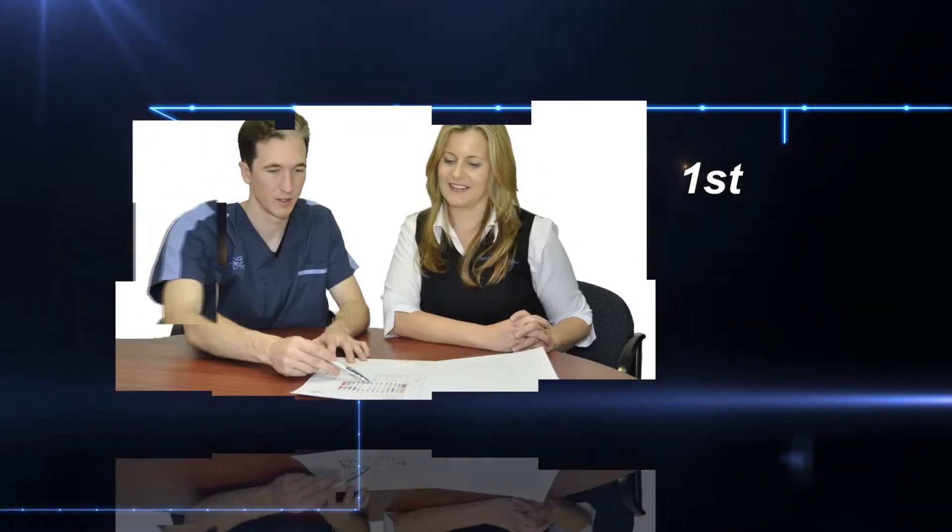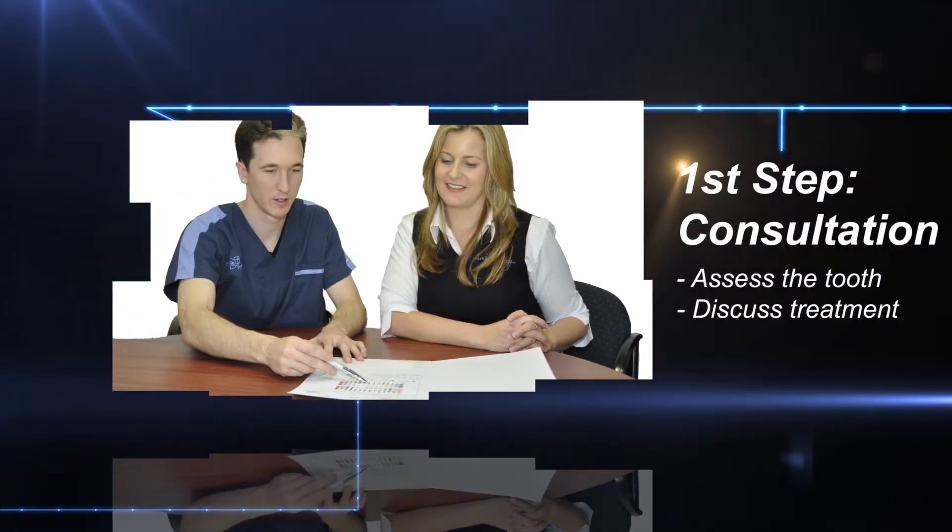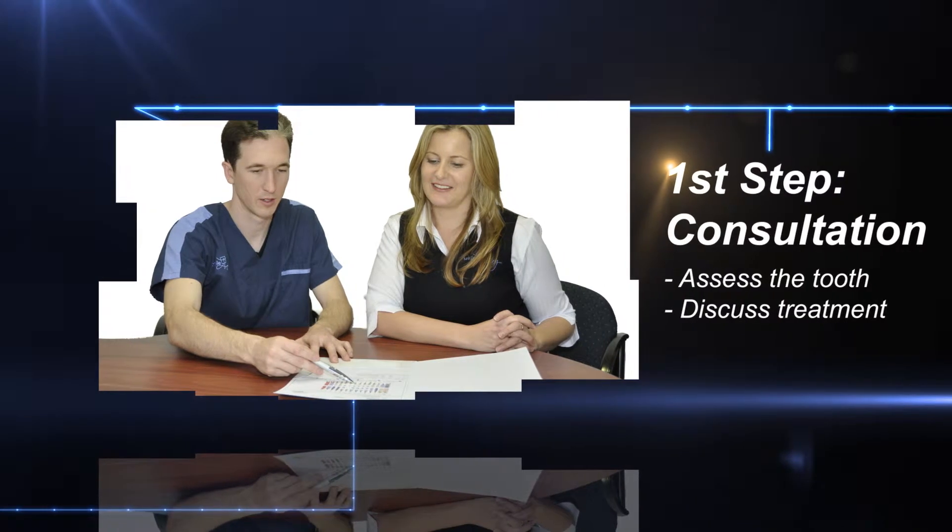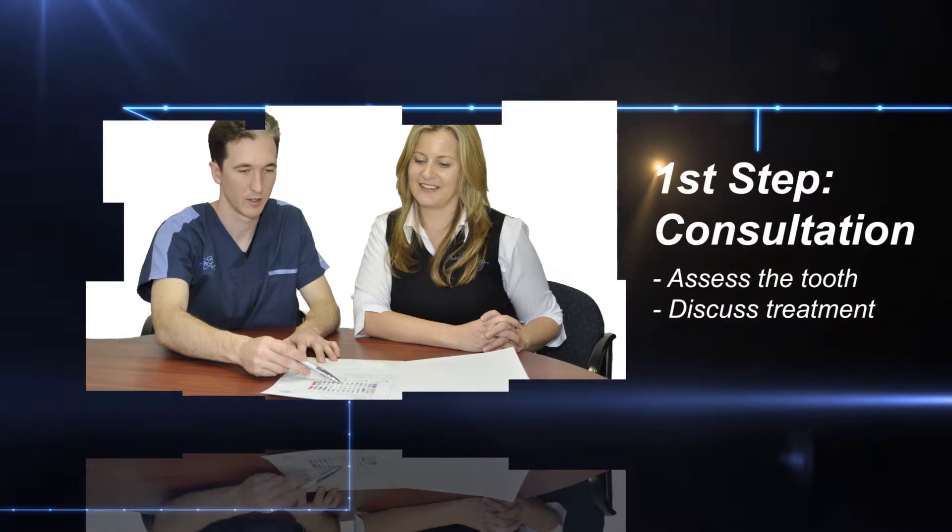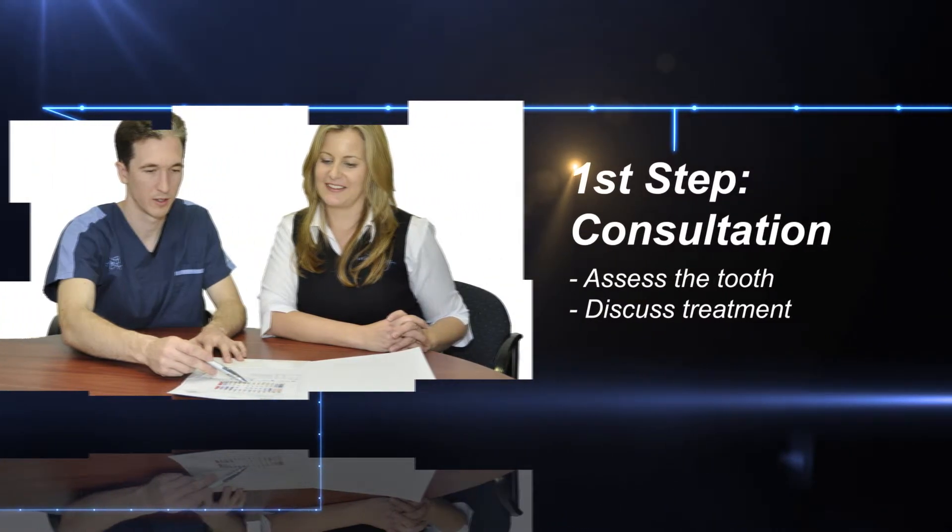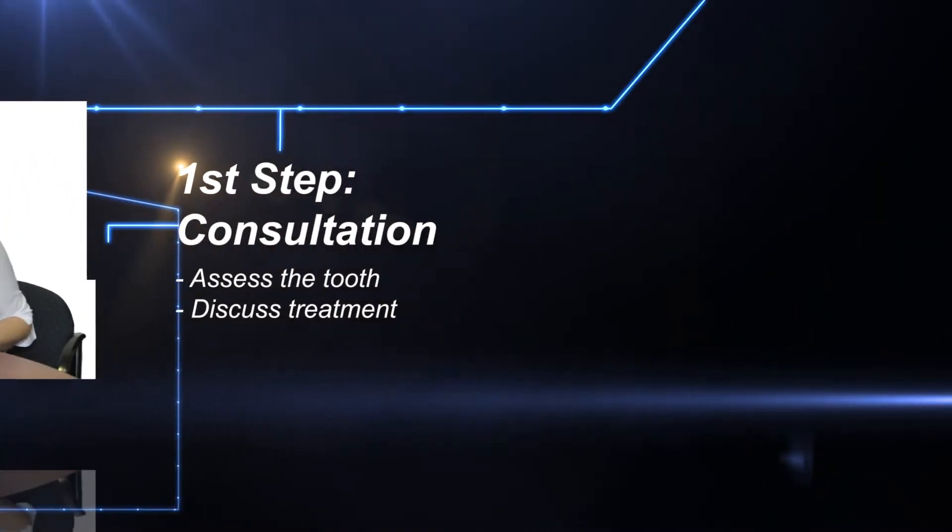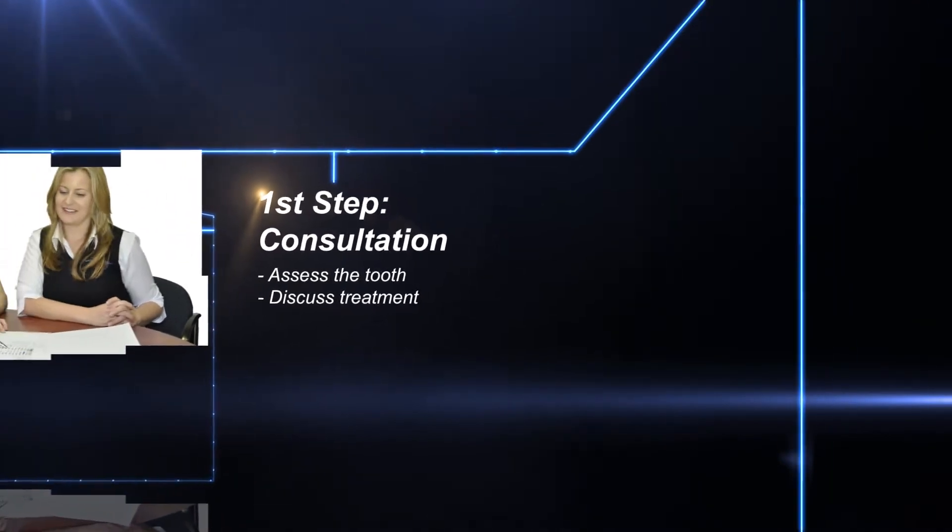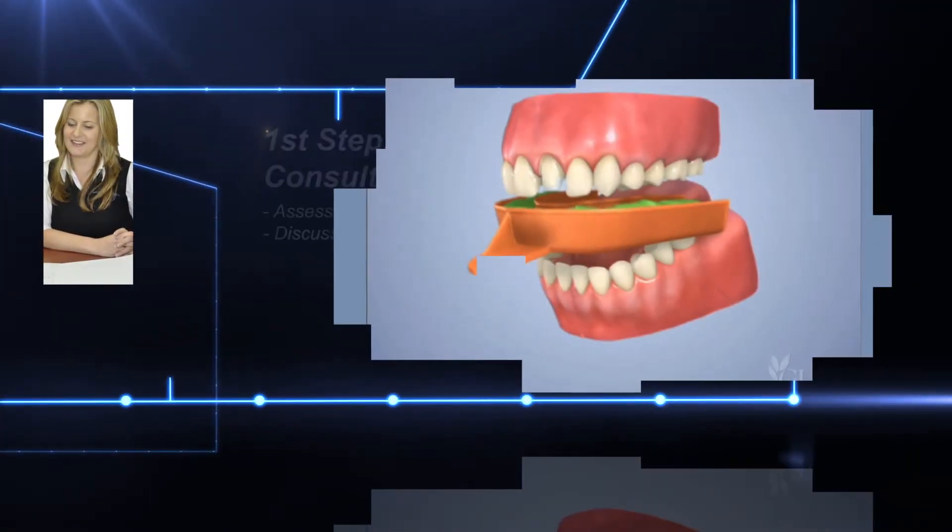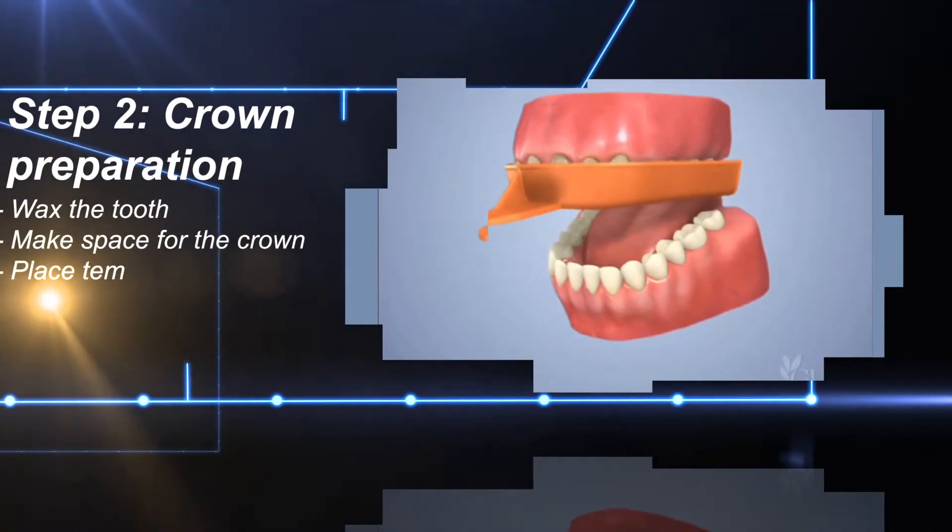The first step of getting a crown is the consultation, where we assess the tooth and discuss the best treatment. A week later, we prepare the crown. We wax the tooth to help determine the correct shape, look, and fit.